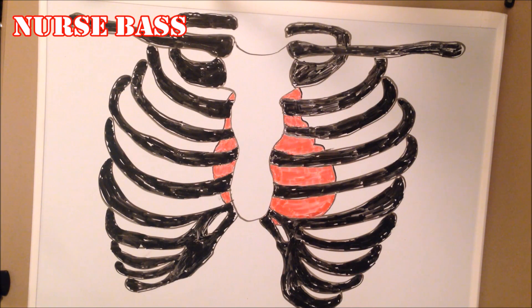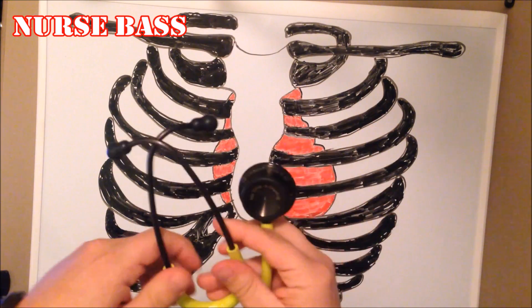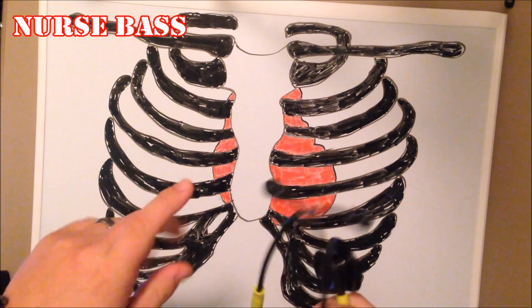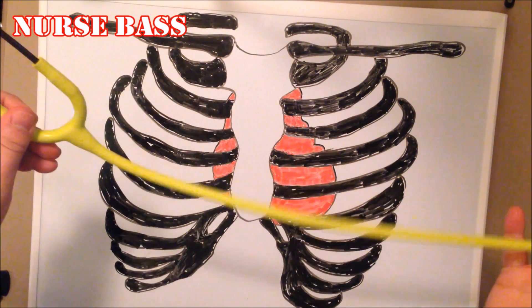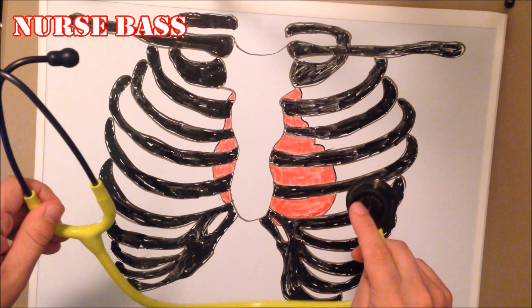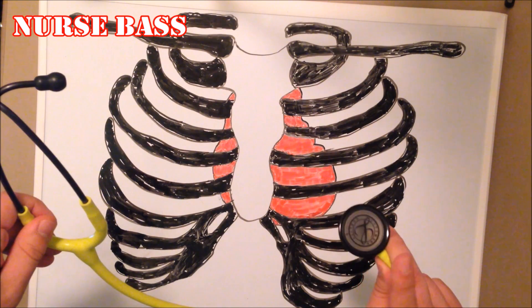Now let's talk about the actual stethoscope. I'm keeping this real simple and basic. Here you have a stethoscope — this one happens to be from Littmann. You have your two ear pieces, the actual tubing, and then the chest piece. On the chest piece you have the bell and then the diaphragm.